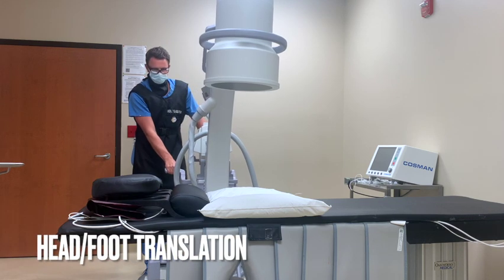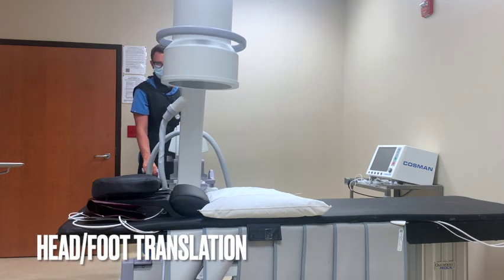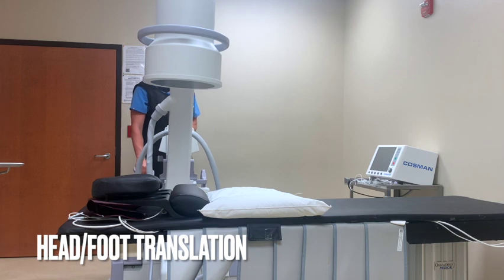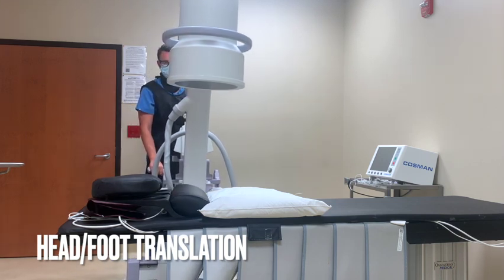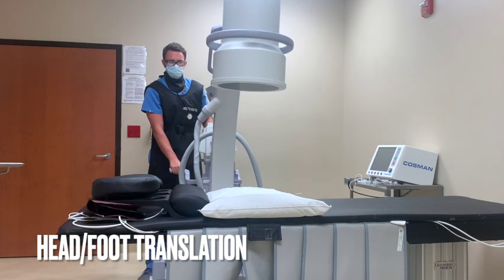Next, we are going to do a head or foot translation. This is when the C-arm moves parallel to the patient, either superiorly towards the head or inferiorly towards the feet.